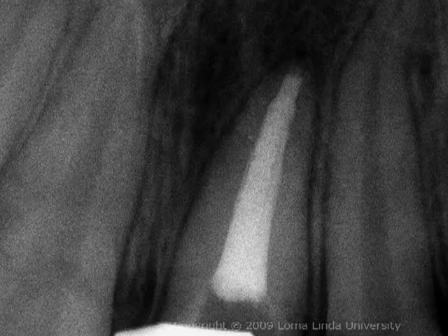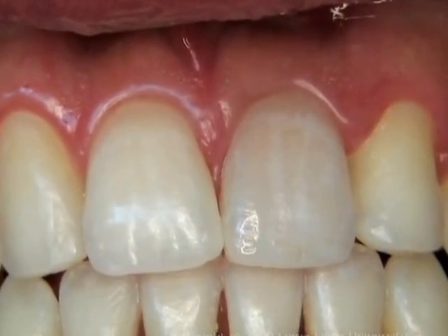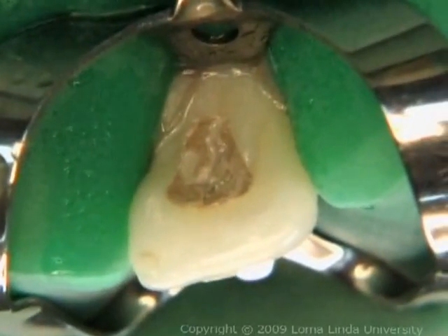Radiographs are taken to assess the status of periapical tissues and the quality of root canal treatment. The quality and shade of any restoration present are assessed. If defective, the restoration is replaced.